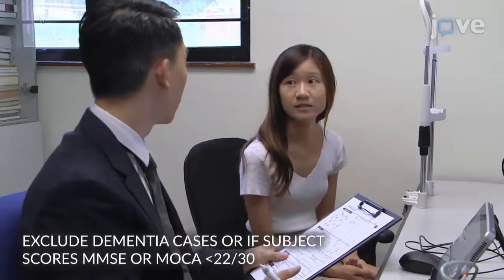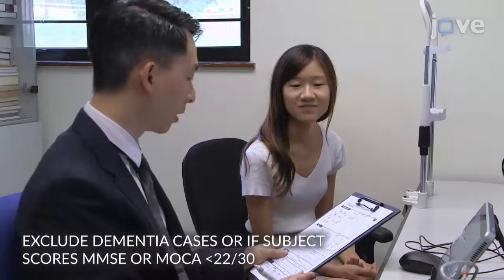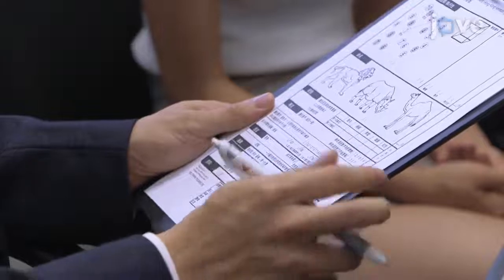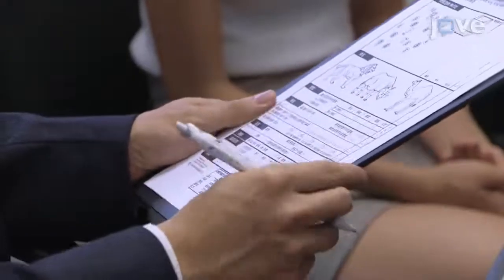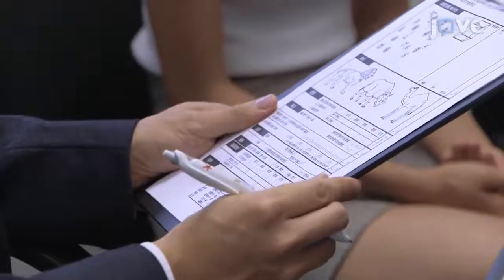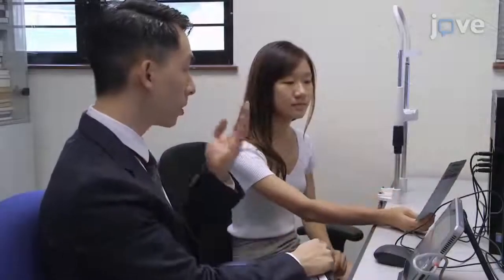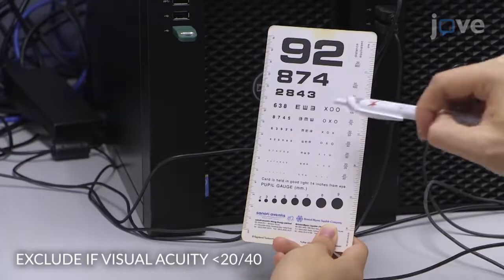After conducting a clinical diagnostic interview with the subject and, if available, their relatives, to exclude dementia and to screen for cognitive impairment using the Mini Mental State Examination and Montreal Cognitive Assessment, evaluate the subject's visual acuity with a Snellen chart.